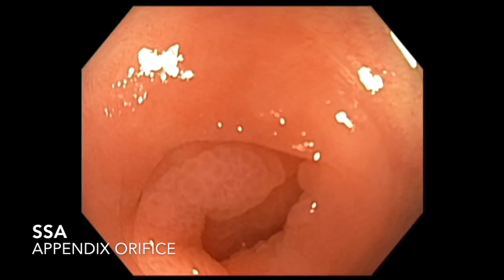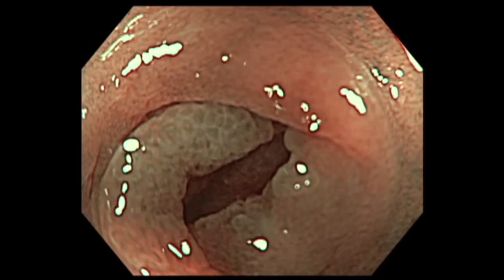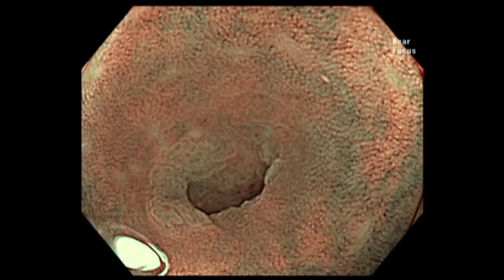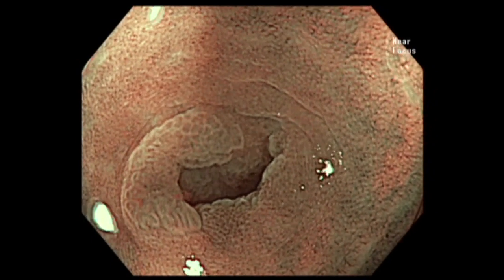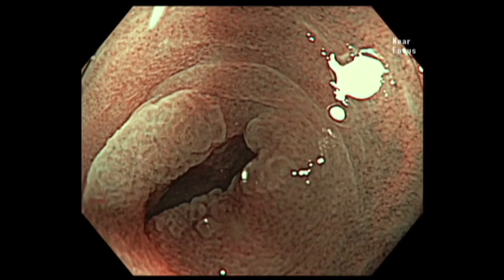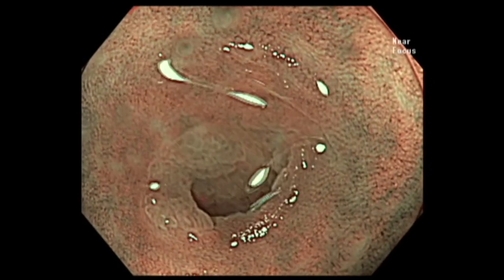This lesion involves the orifice of the appendix, and when we apply NBI the picture is much more clear. You can define it further by using the near focus function and putting a little bit of water. As you can see here with the near focus function, the sessile serrated adenoma occupies the orifice and actually extends into the appendix.